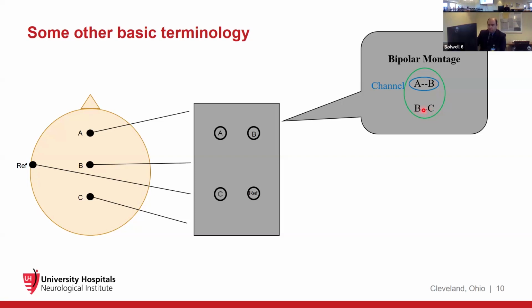And you will do the same. So if you want to extend it more, if you have more electrodes, you take C to D, D to E, so on and so forth until it ends. Okay. This is an example of a bipolar chain. So if you have a montage of different chains and they're all bipolar, that'll be a bipolar montage. I'll show you some examples.